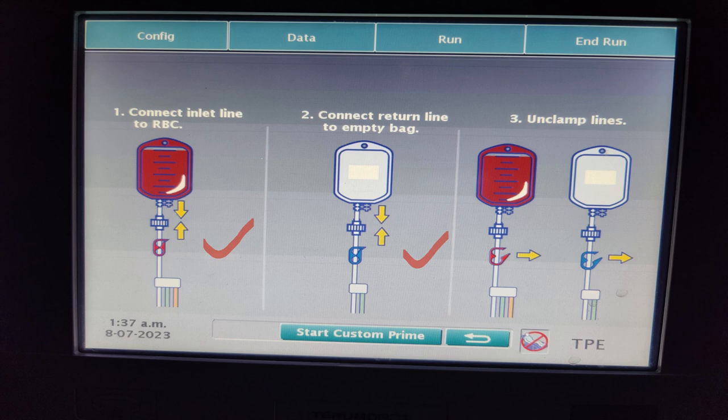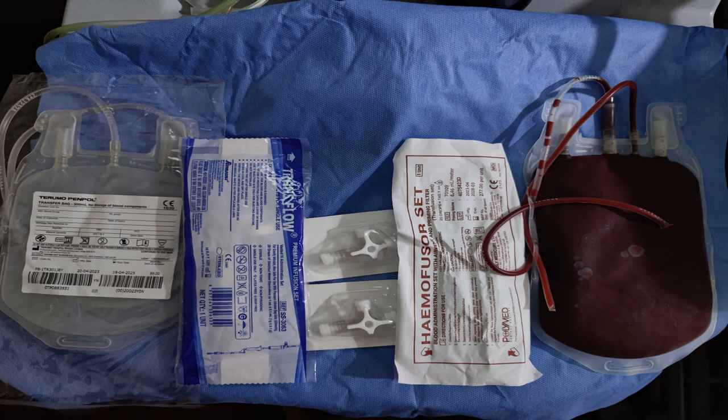In order to maintain this circuit, these are the items that we will require: a PRC unit, a blood transfusion set, a Romsen IV set, a transfer bag, and two three-way connectors.